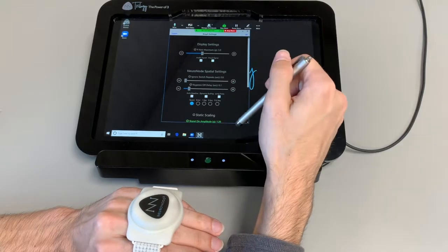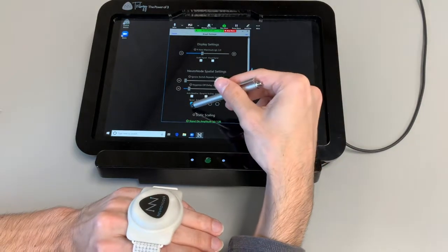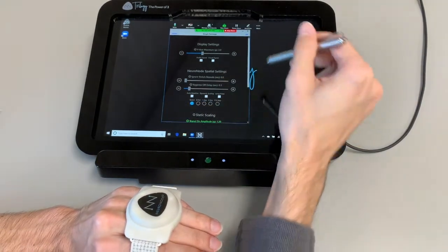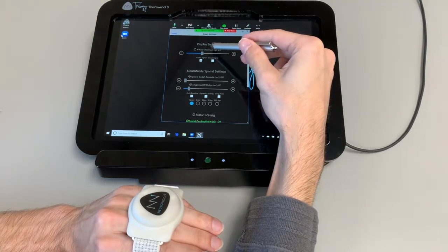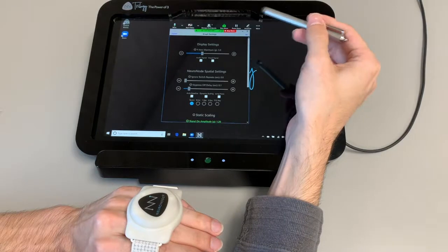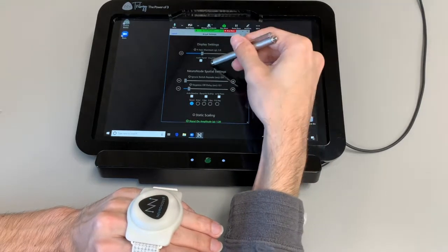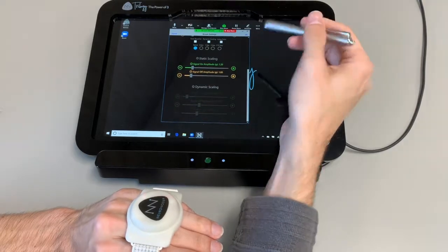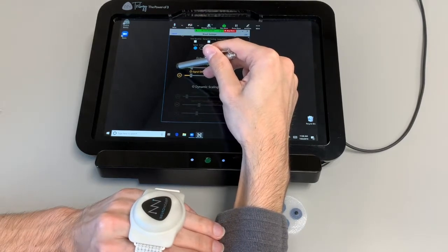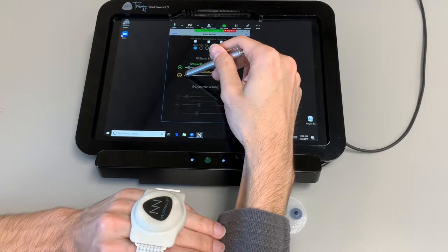Long press, I would not suggest being used for spatial, because that's basically just requesting that you're doing a lot of motion consistently. Same thing with your Space, Enter 1, 2, and F12 key — it's basically going to be the keyboard key that you send when you make a switch. We'll keep that on Space for now. Your Y-axis maximum — you'll see that now instead of a microvolt symbol, you have a G symbol. So instead of it being 100, we don't need that much; this is just going to be three Gs. Our audio signal is on to beep whenever we make a signal, and we'll leave visual signal off. So where we were is about 0.5, so we're going to take the green line down to about 0.5 and the yellow line down to about 0.4, so they'll be close but somewhat discernible.